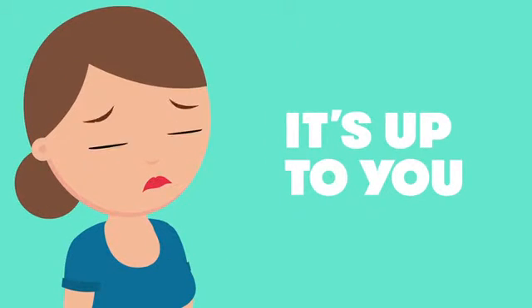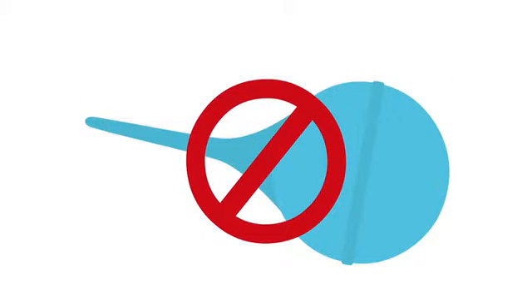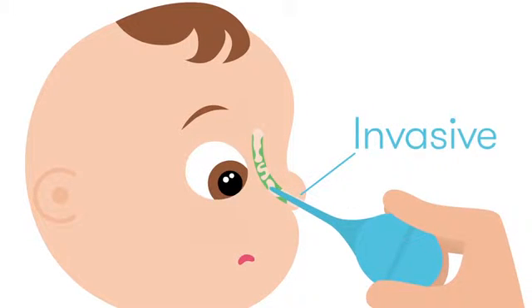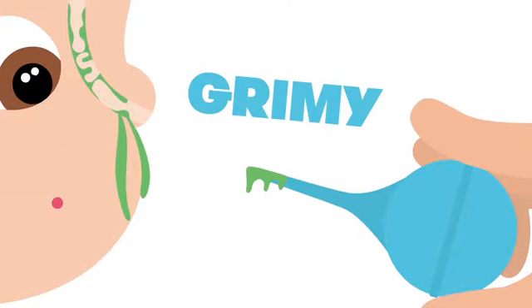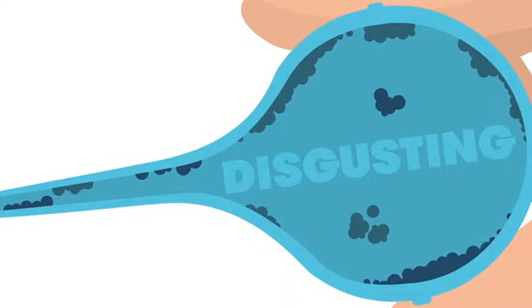It's up to you to keep their nose clean and clear, but it's not easy with that outdated bulb syringe. They're invasive, but worse, they're near impossible to clean. So they're grimy, slimy, and downright disgusting inside.